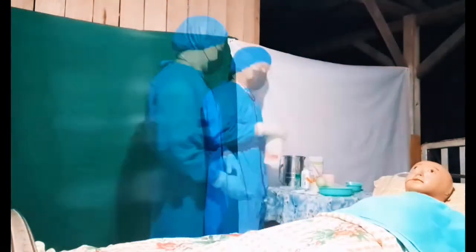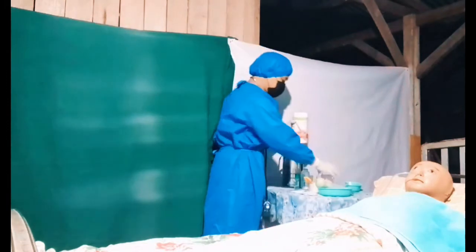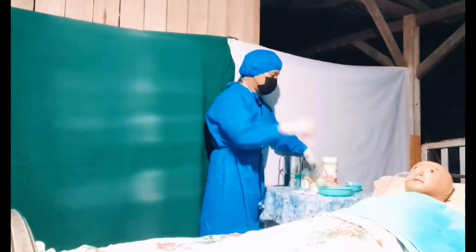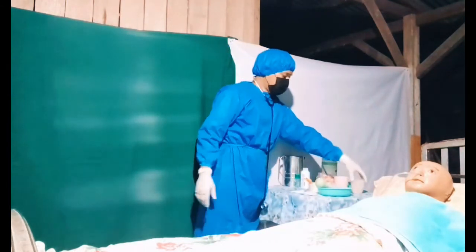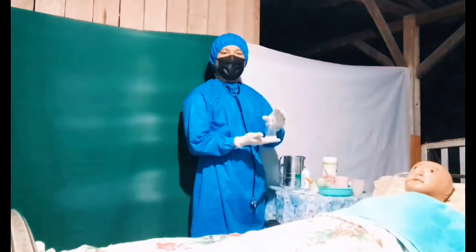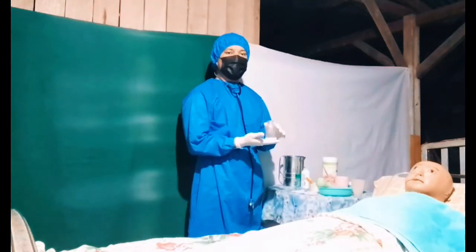Prepare the Insure, assuming that I've already prepared it. So there is the Insure and water, and of course the medication. If the doctors have a medication for the patient, you must follow it.